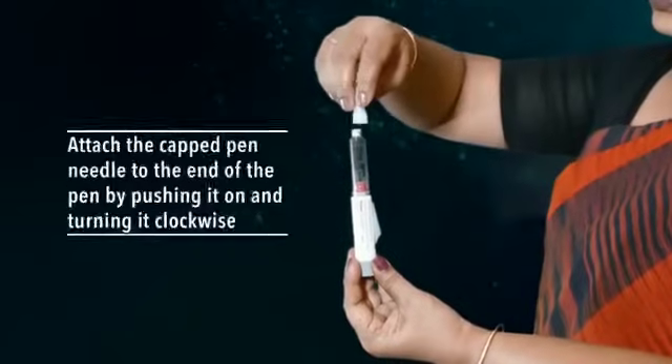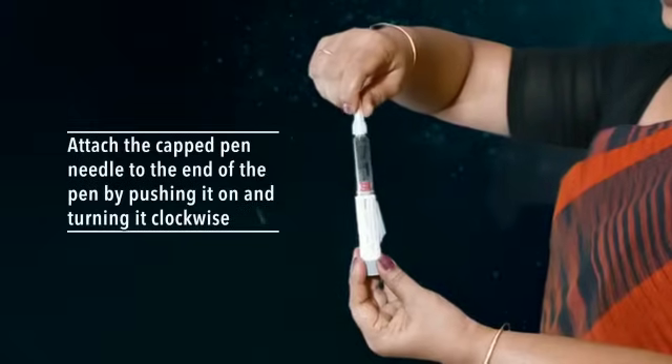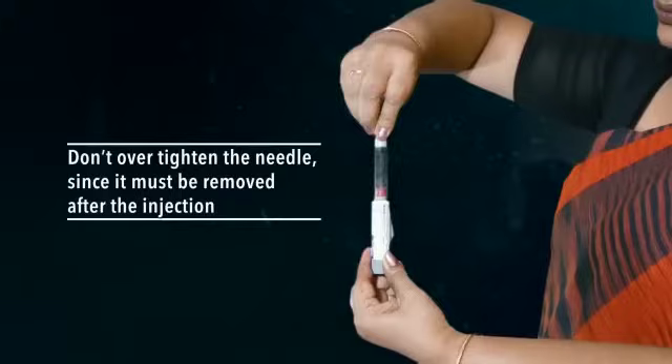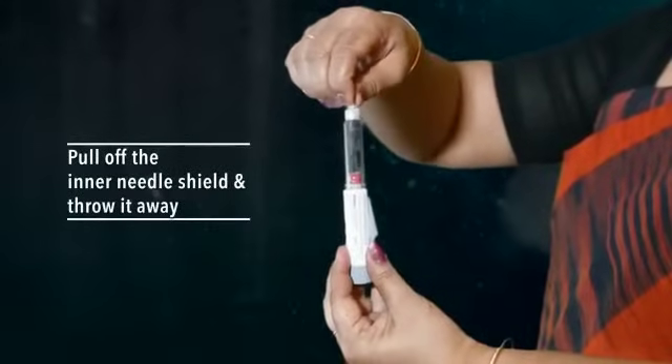Number one: attach the capped pen needle to the end of the pen by pushing it on and turning it clockwise. Don't over-tighten the needle, since it must be removed after the injection. Number two: pull off the inner needle shield and throw it away.